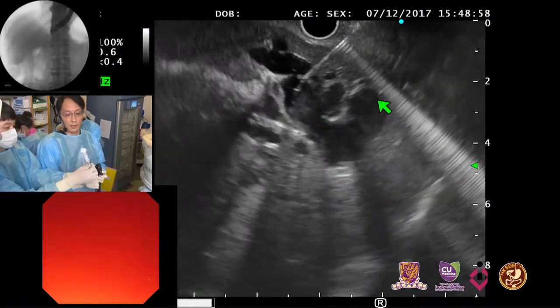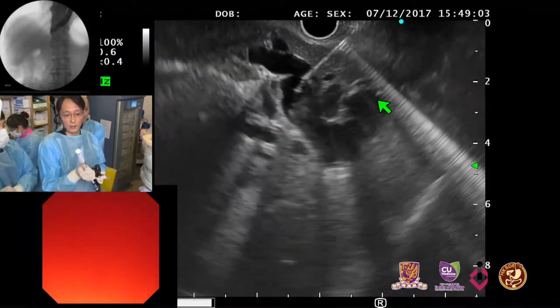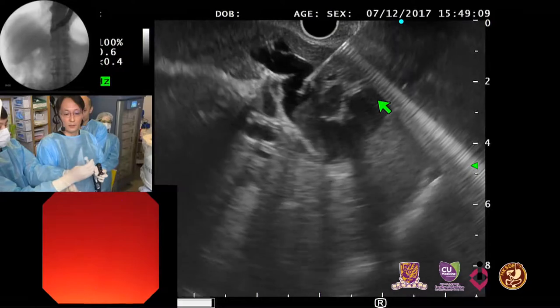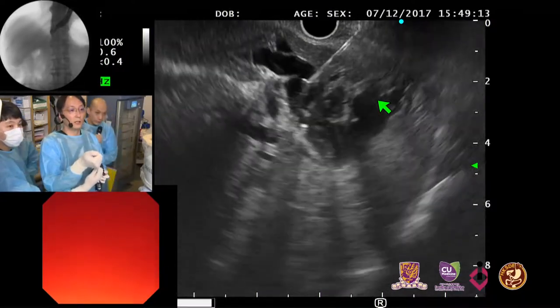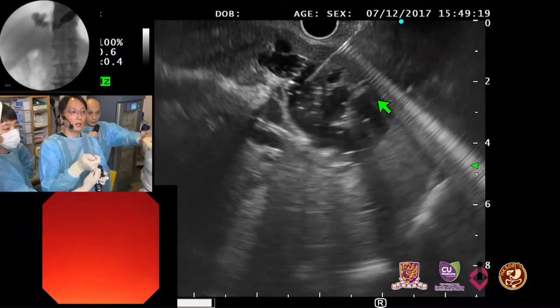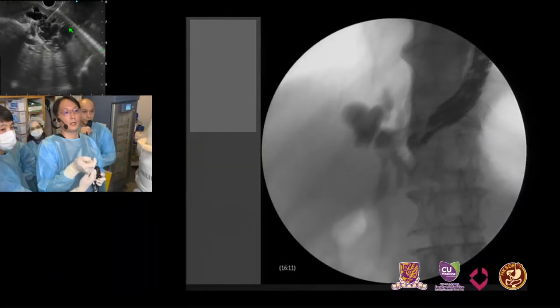It's too easy for you. Right. Then by here, then injection. Please. Some whitish bile. So maybe a prolonged obstruction. Then X-ray. Okay. It's a marked dilatation. Looks like PC, right? I think.